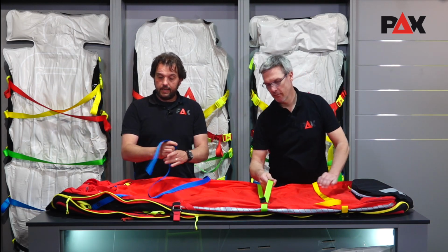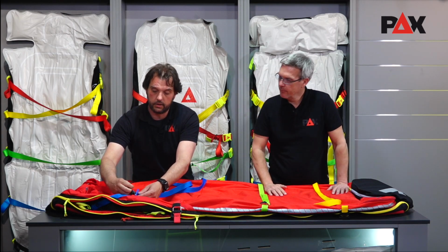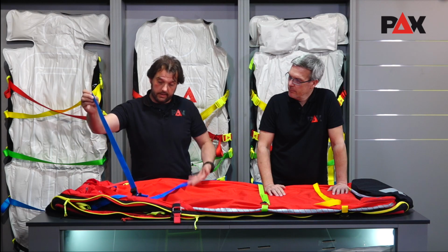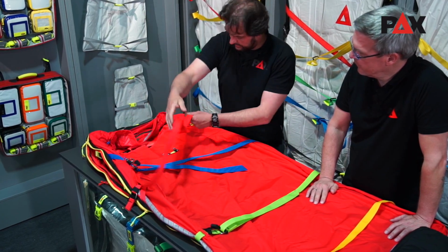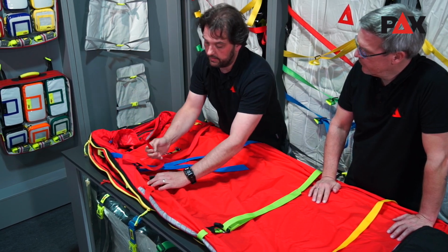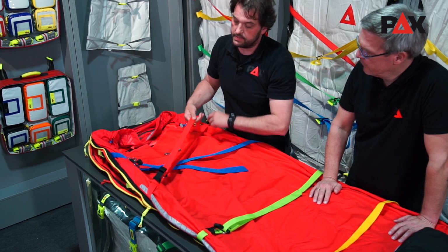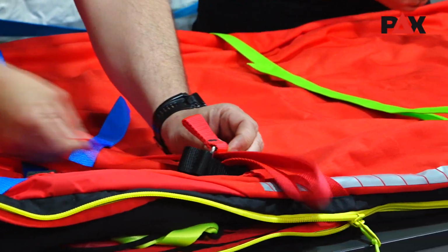In the chest area, the compression straps are crossed. They are color coded. So you have the loose end, in that case in blue, and the end with the buckle in blue. And then you have here the red one that is connected with the red buckle side. So that prevents mistakes while securing the patient.